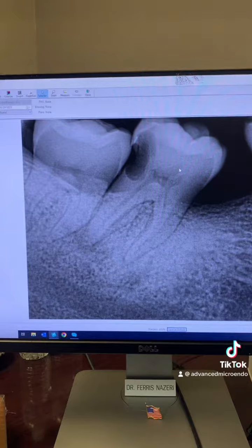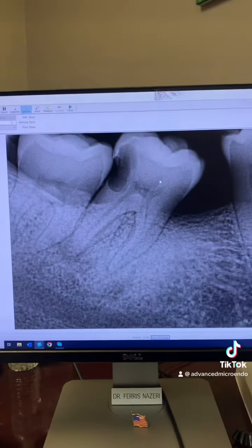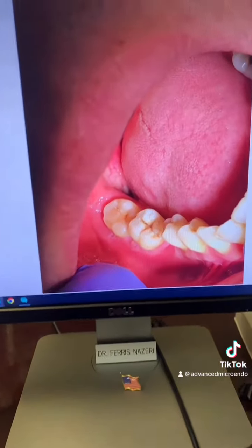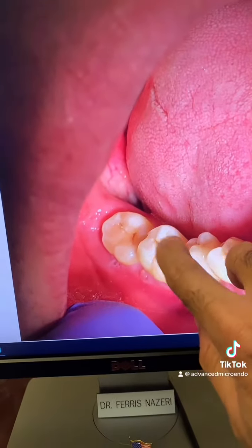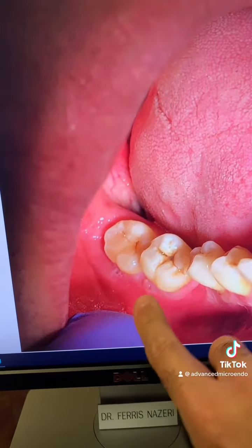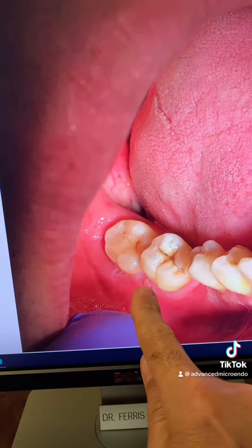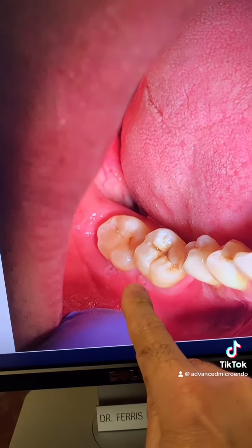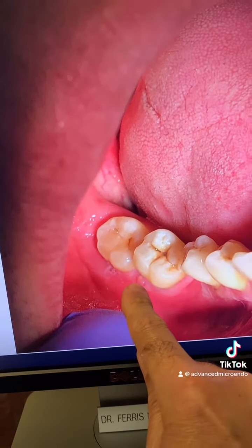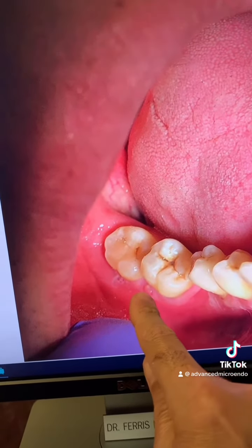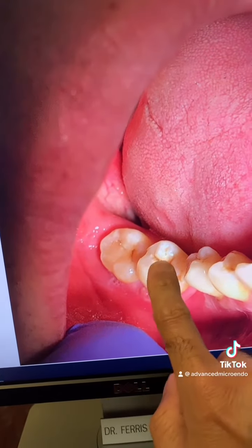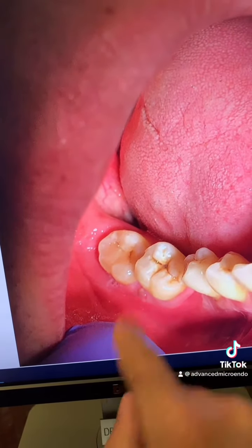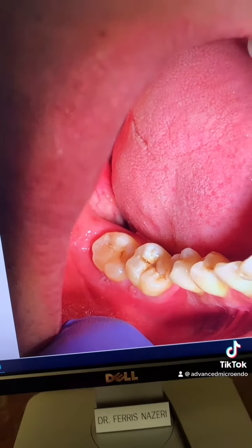Let me show you the sinus tract. Here's the tooth and here is the sinus tract right here. That's the sinus tract. That's the tooth.